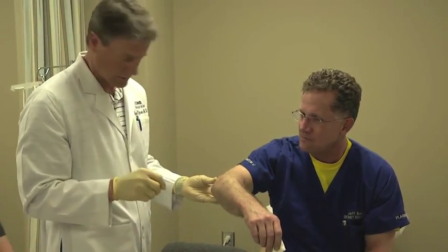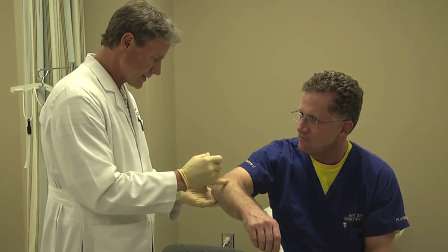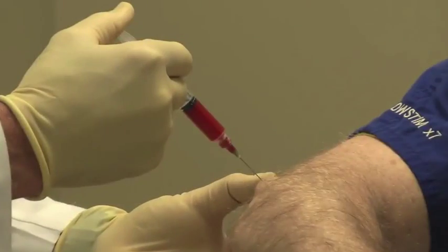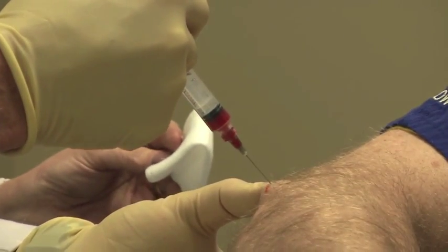We'll then prep the area and clean it, and we'll first inject an anesthetic into the skin, since the injection needle for the PRP is a little bit larger and can be uncomfortable. Finally, we'll inject our PRP directly into the tendon area.